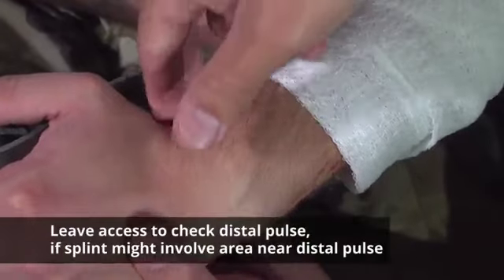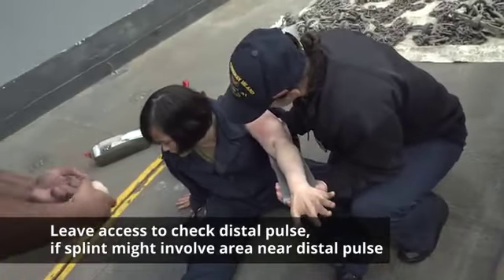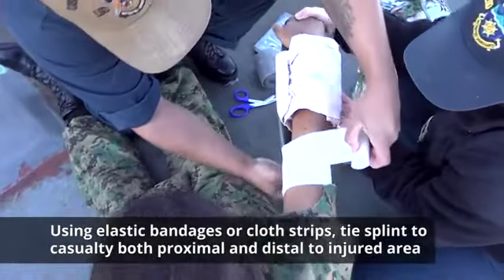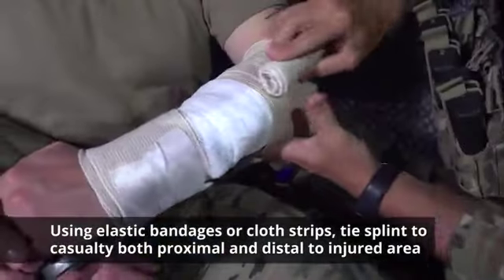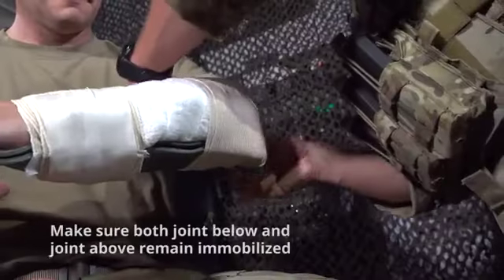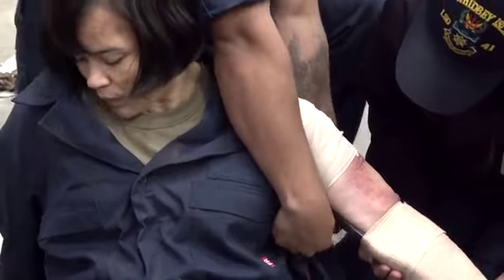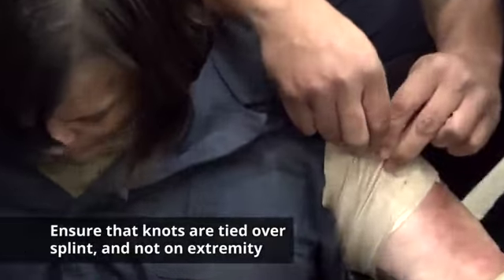Make sure to leave access to check a distal pulse if the splint might involve the area near the distal pulse. Then, using elastic bandages or cloth strips, like cravats, tie the splint to the casualty both proximal and distal to the injured area, avoiding pressure directly over the injury. Make sure that both the joint below and the joint above remain immobilized. Also, ensure that the knots are tied over the splint and not on the extremity.